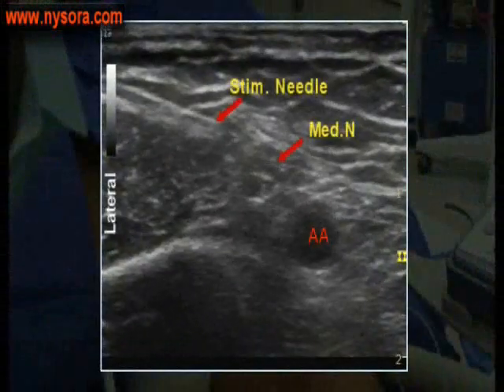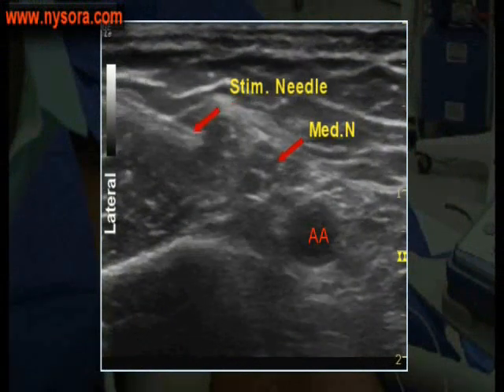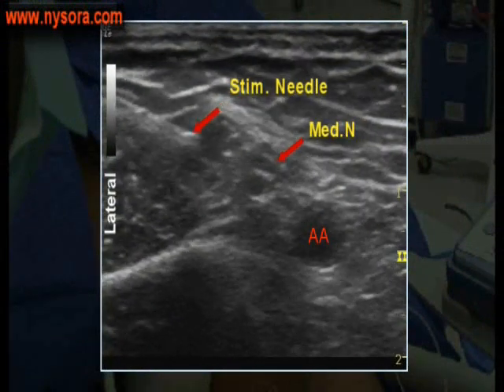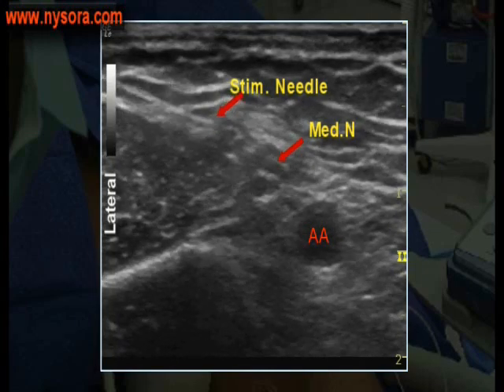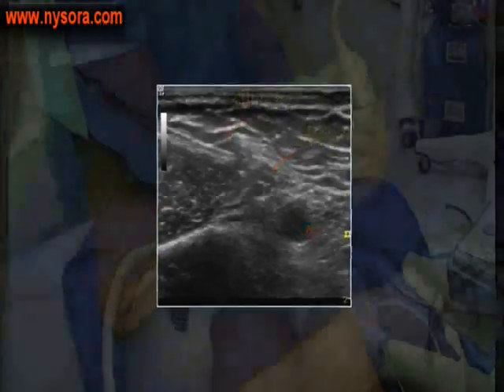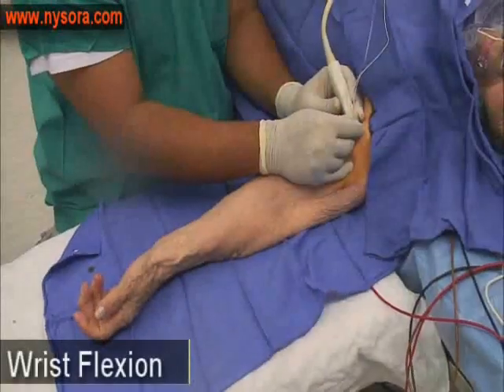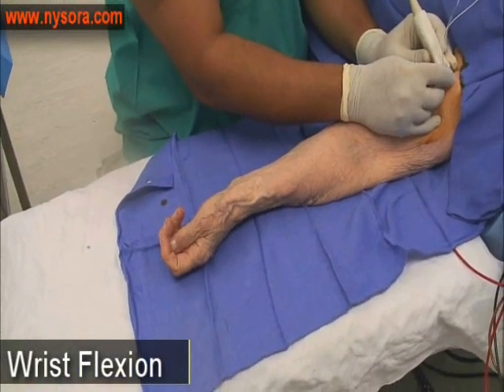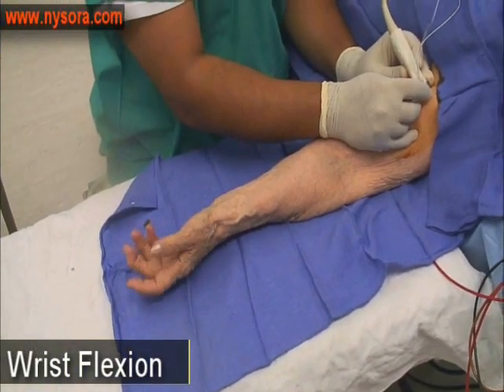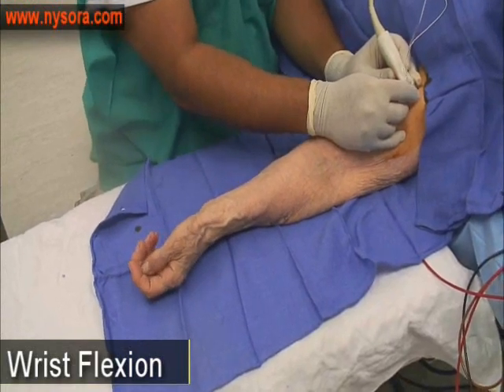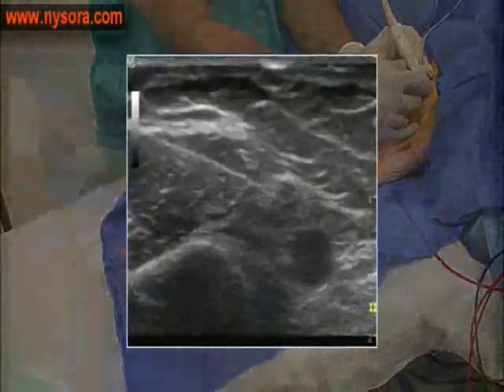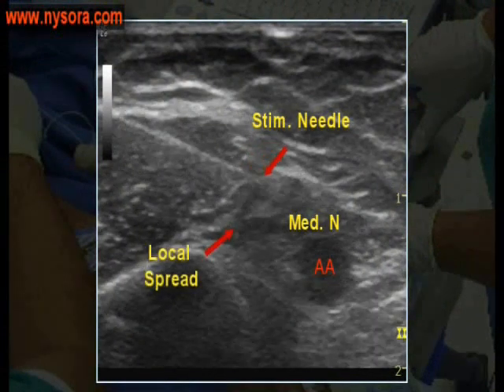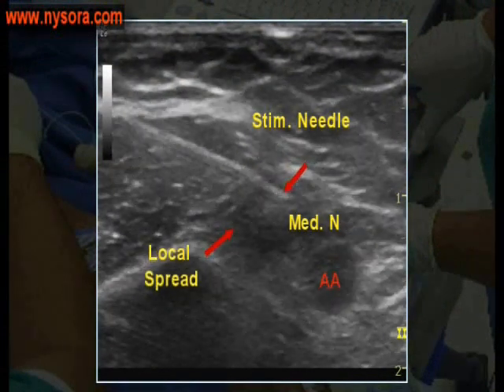This sequence shows the needle approaching the median nerve. As the needle approaches the median nerve, a motor response is elicited. Local anesthetic is then injected in the vicinity of the median nerve.